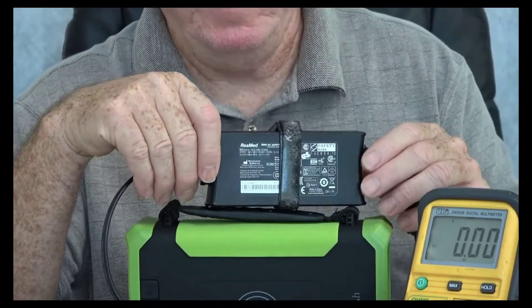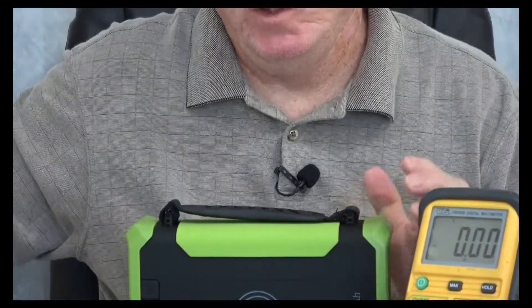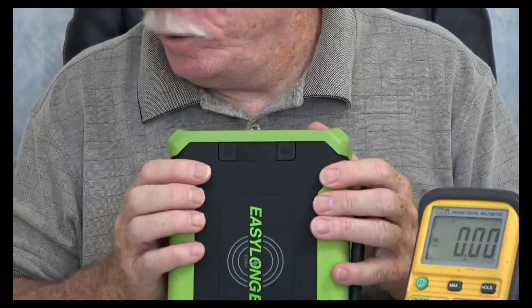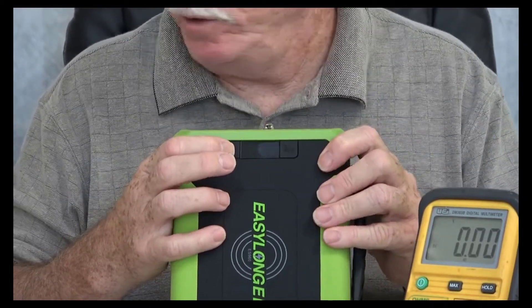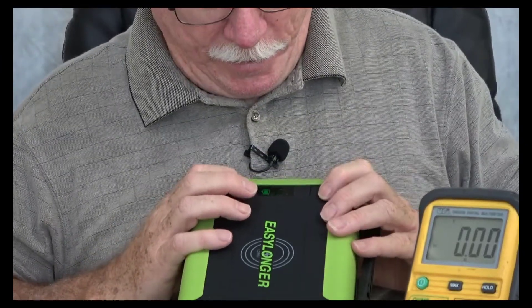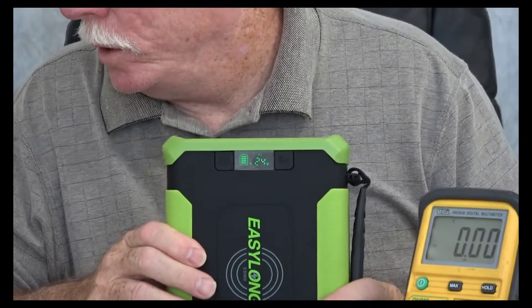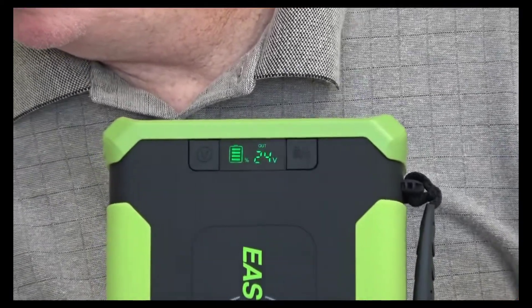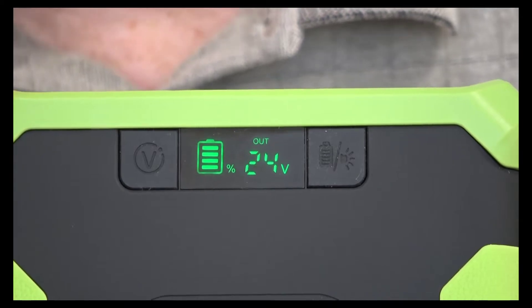So, two different ways I've verified that this AirSense 10 machine uses 24 volts. Now that I've established that, I need to set the battery for 24 volt output. The V symbol is the voltage selector. I long press that and you see it shows 12 volt — it's flashing. I hit it again to 16, hit it again to 20, and finally hit it one more time to 24, and the 24 volts is flashing. Let me zoom in on that a little bit so you can see — now I have this set for 24 volt output.